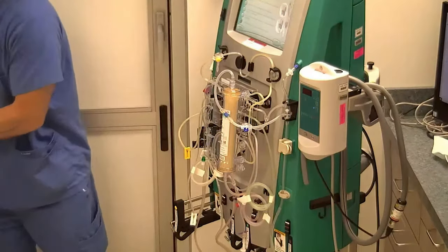The next step is for our replacement line. It has a purple line. So we find our purple tubing. We're going to connect our saline bag over here. Close our scale.